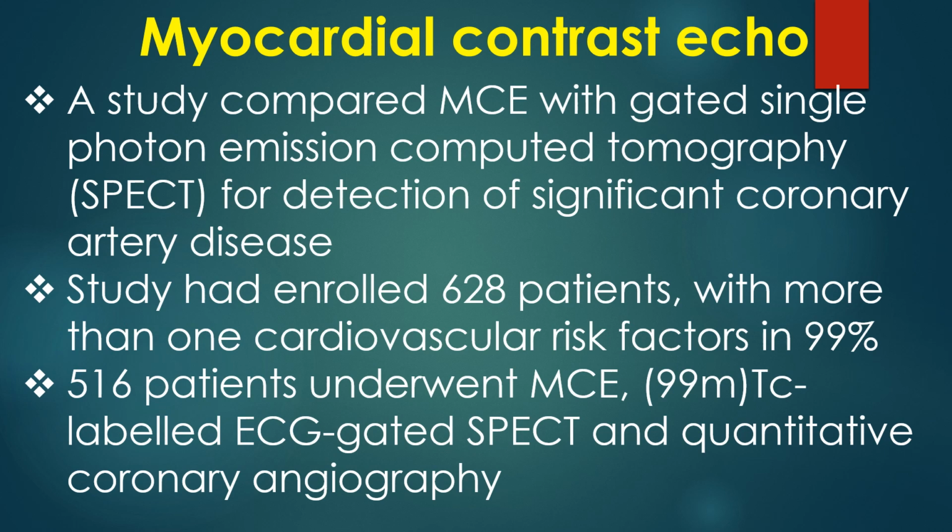A study compared myocardial contrast echo with gated single photon emission computed tomography for detection of significant coronary artery disease. The study had enrolled 628 patients with more than one cardiovascular risk factor in 99%. 516 patients underwent myocardial contrast echocardiography, technetium-99m labeled ECG gated SPECT, and quantitative coronary angiography.